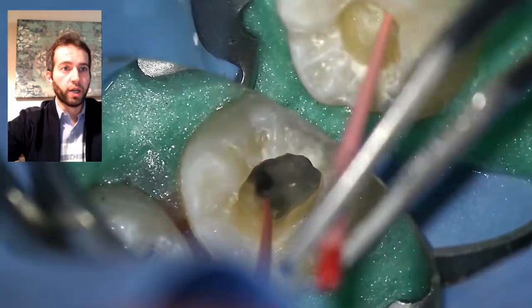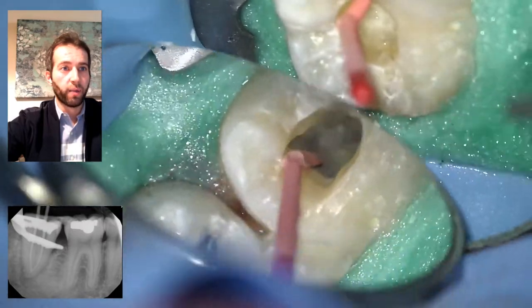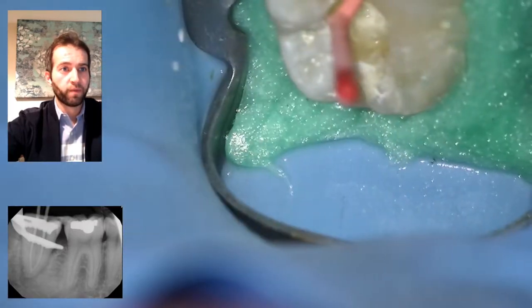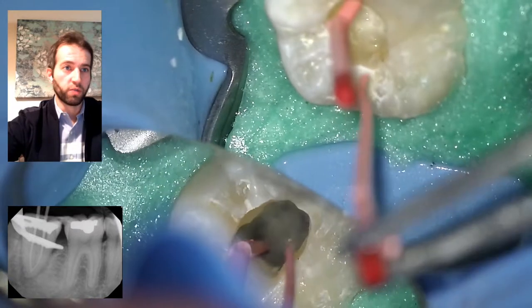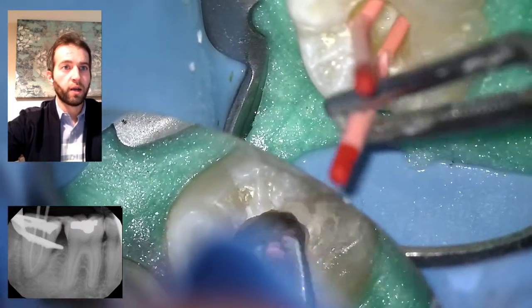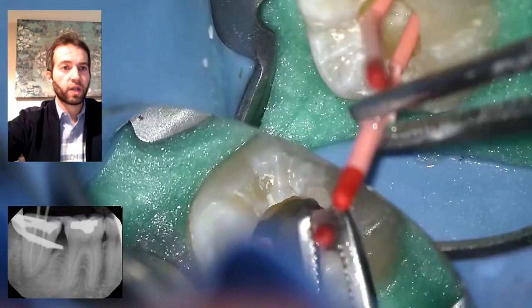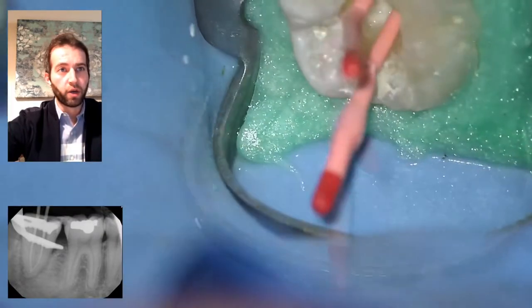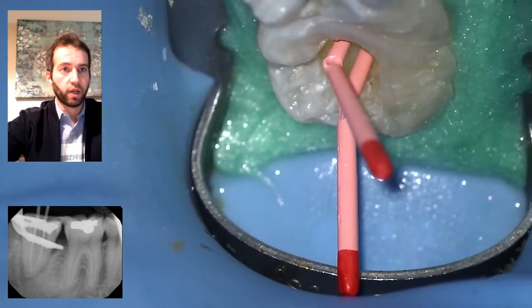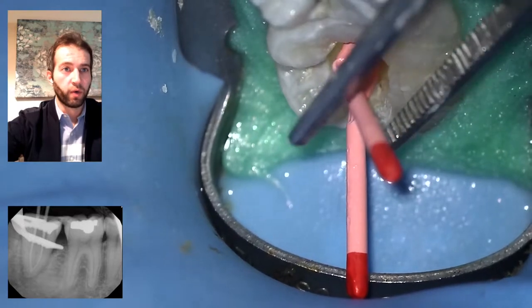Once I make a mark, I know that once I place it with sealer, it will go to that length. You can see how I made a notch into that gutta-percha right where the cusp-of-surface margin is — that's my reference point. I place the distal canal, knowing for sure that I'm at the correct length, but it's always good practice to take a cone-fit radiograph to confirm the right length.